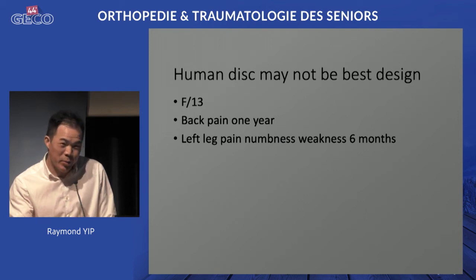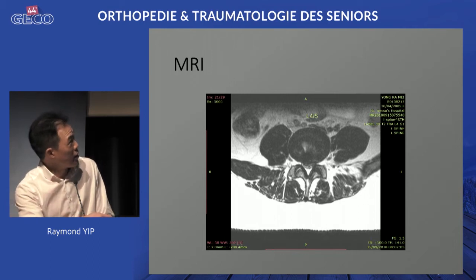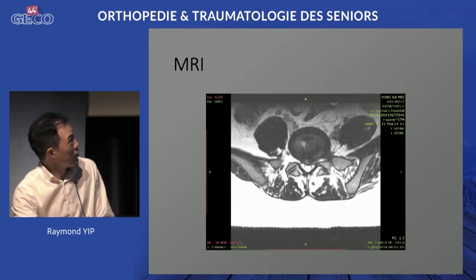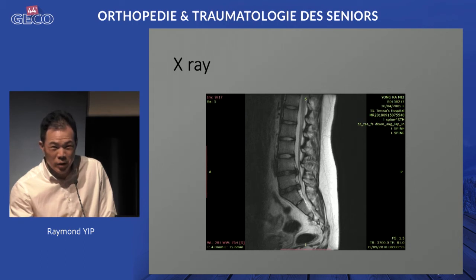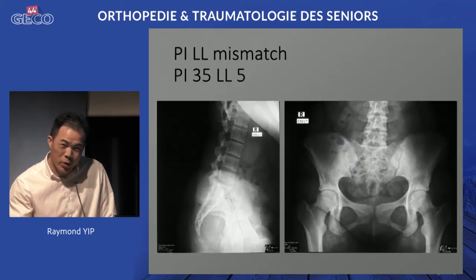And this is my youngest patient for a lumbar TDR, a 13-year-old. Back pain for 1 year and developing leg pain for 6 months. And you can see that the L4-5 disc has herniated, causing compression of the left L5 nerve root here, and the L5-S1 likewise as well. So she's got compression of L5 and S1 traversing nerve roots, and a double lumbar disc herniation at the age of 13. So do we simply do a microdiscectomy, which was what was offered to this patient initially, or should we do something else? After we look at her standing x-rays, you see there's no lumbar lordosis. So just a simple decompression may not suffice.